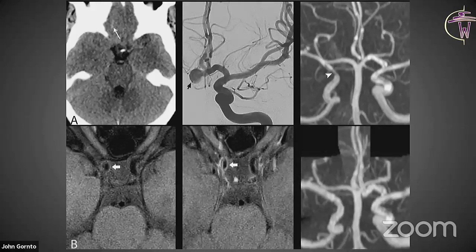In addition, we had a couple cases where the vessel wall imaging did a better job than the modified Fisher grade in terms of prediction of vasospasm. This was a case with a prominent ACOM aneurysm right here that had ruptured. You can see a little bit of hemorrhage here in the anterior sulcus. It was a Fisher grade 1. And on the vessel wall imaging, you can see clearly enhancement involving that supraclinoid ICA there. And this patient subsequently developed vasospasm in that same segment that was enhancing. So it could potentially contribute to prediction of vasospasm in these sort of settings.